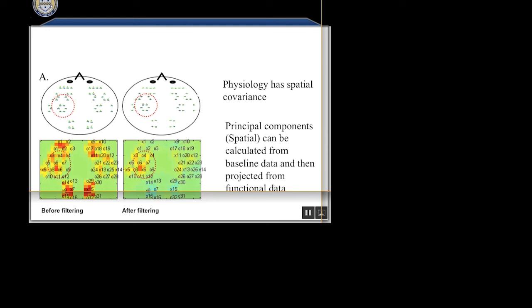The problem with principal component analysis is, one, I said you have to have the right probe, it has to be big enough, and two, how many components to remove and which components becomes a challenge. Just like filtering, if I remove too many components, maybe the first component knocked it down, maybe the second component is more focal, remove the third component, all of a sudden what I was calling brain activity disappeared because I've over-filtered now. There is a question of where do you stop and how did you know to stop there?